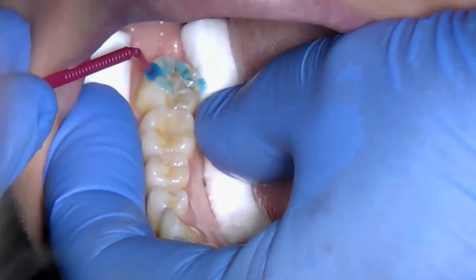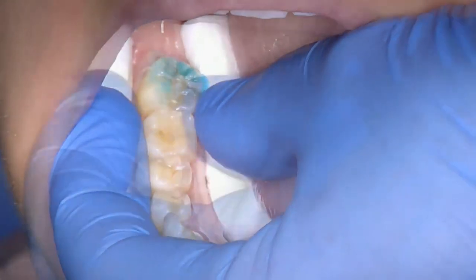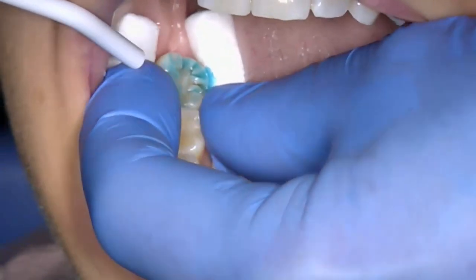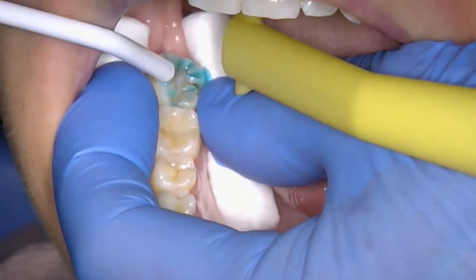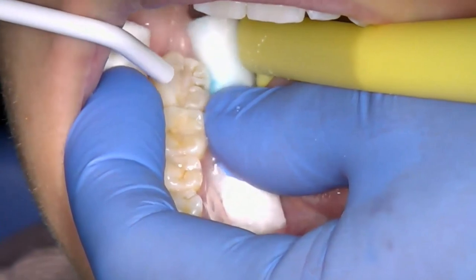As acid etch has the potential to cause burns to the oral soft tissues and skin, care must be taken not to blast the etch off and shoot it out of the mouth. Once the fissures of the tooth and surrounding areas are completely free of etch — it could take around 10 seconds of rinsing to remove the etch effectively.